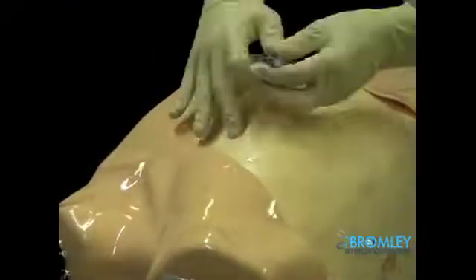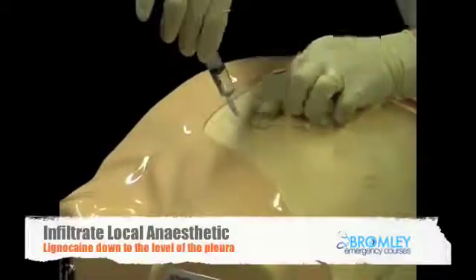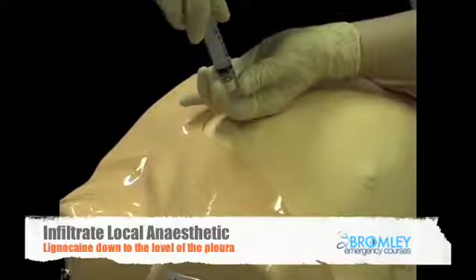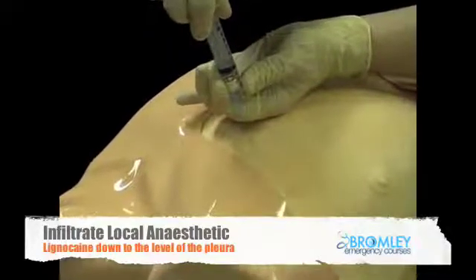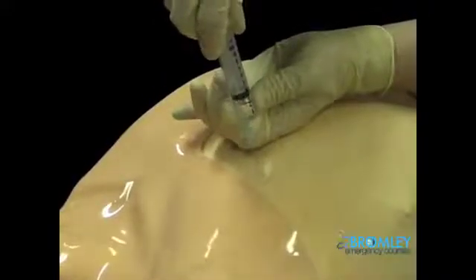Next, infiltrate local anaesthetic down to the level of the pleura. I'm going to infiltrate underneath the skin and then all the way down to the pleura.